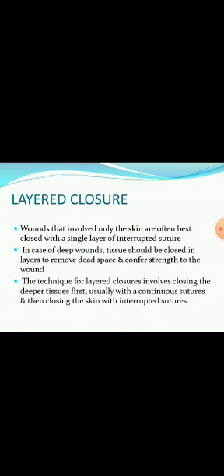Layer closure. Wounds that involve only the skin are often best closed with a single layer of interrupted suture. In case of deep wounds, tissue should be closed in layers to remove dead space and confer strength to the wound. The technique for layered closure involves closing the deeper tissues first with continuous sutures and then closing the skin with interrupted sutures.